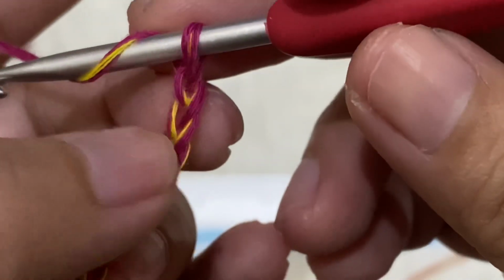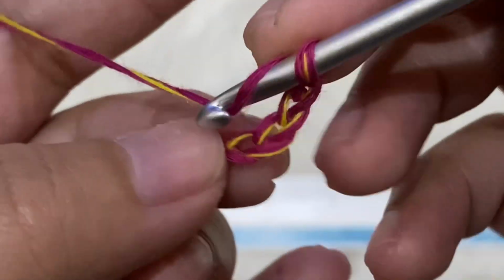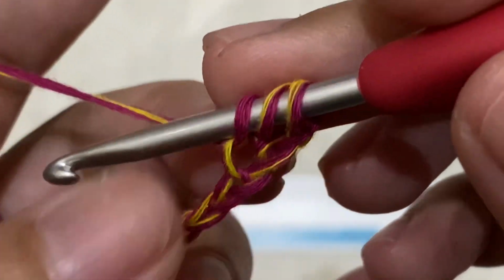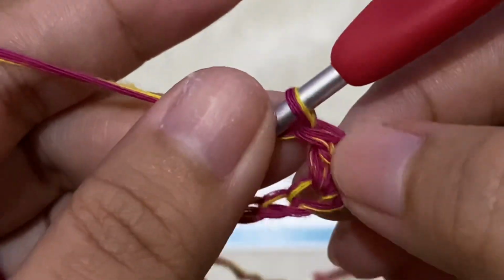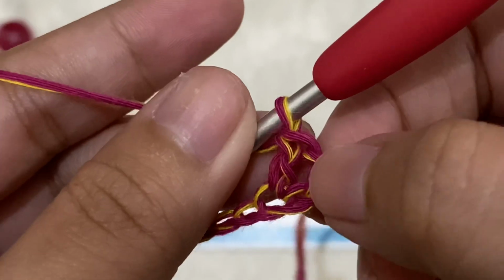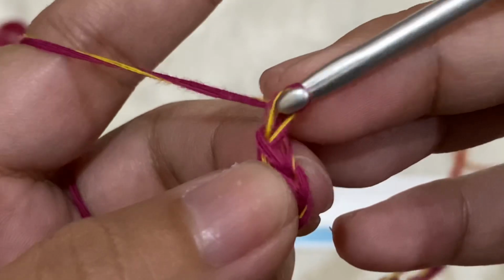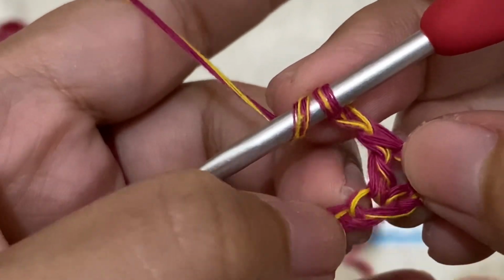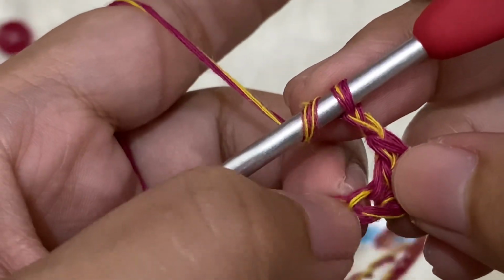Okay, so let's proceed to row 2. So make a double crochet on the 4th chain from the hook. Okay, because the first 3 chains would serve as a double crochet as well. So it means that we already have 2 double crochets right there, and then chain 1. Okay, and skip 1 stitch from your chain foundation. So skip 1 chain and then double crochet on the next one.